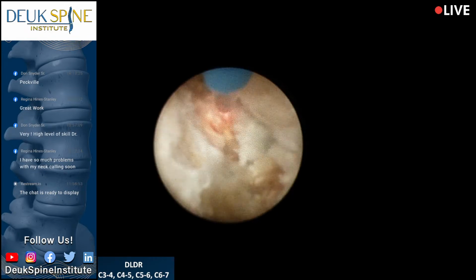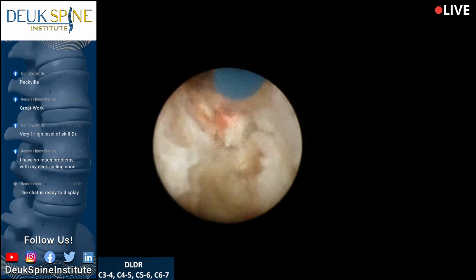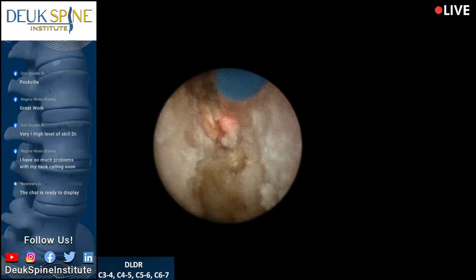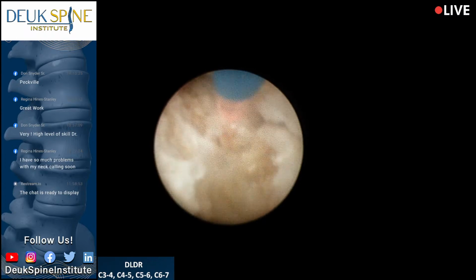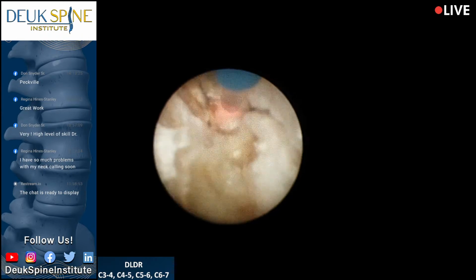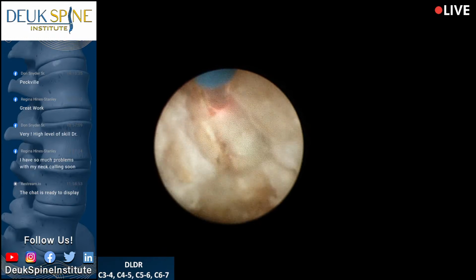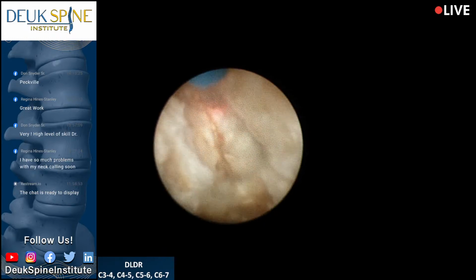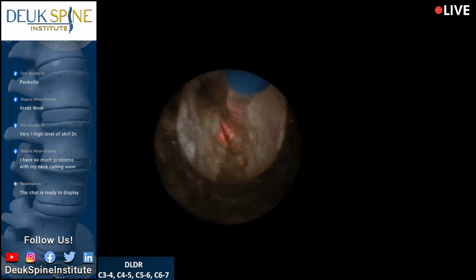These are all just calcified, sclerotic. This is the bone spurs you see on the CAT scans. Oh, the thing is just, it won't come out, but it's absorbing the energy of the laser, and I'm breaking it up in littler and littler pieces. But this is sitting right on the nerve. This is really a calcified, scarred up ligament in the foramen called the foraminal ligament.